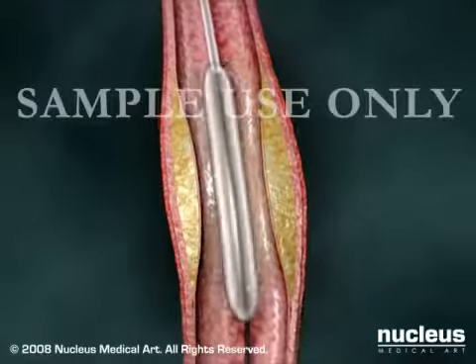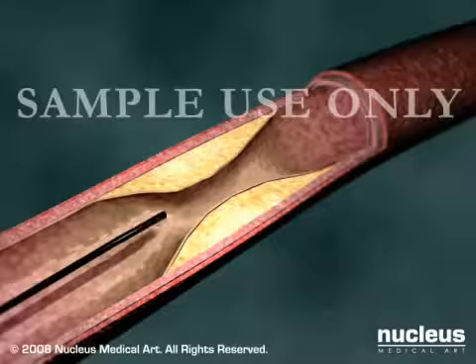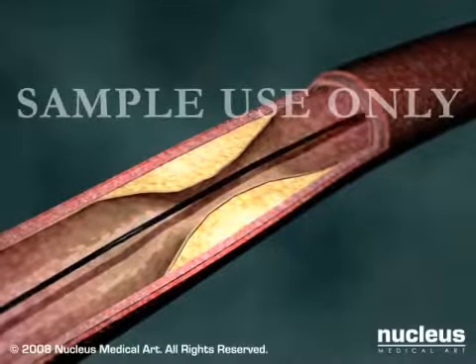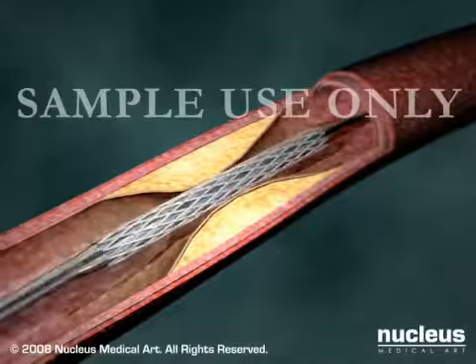Afterwards, your doctor will withdraw the deflated balloon and catheter from your arteries. Some patients will receive a coronary stent, which is a small tube made of wire mesh designed to prop open the artery once it has been treated.